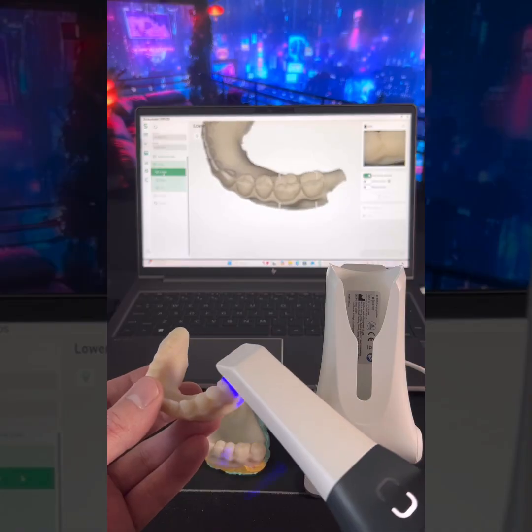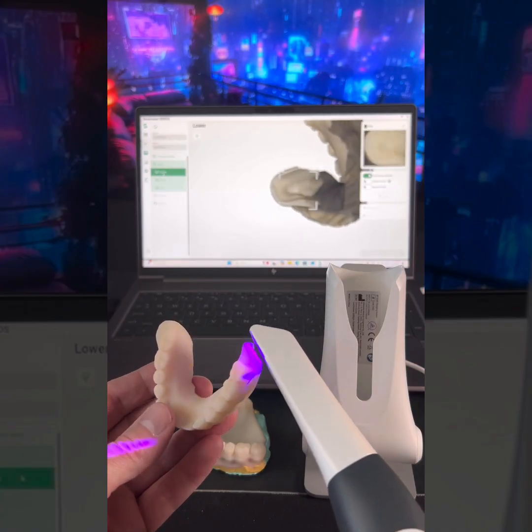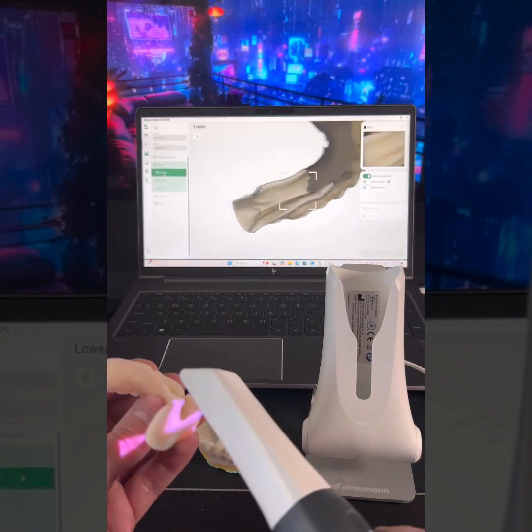Now on to the hard stuff. Let's see how this rolls over. I like it so far.